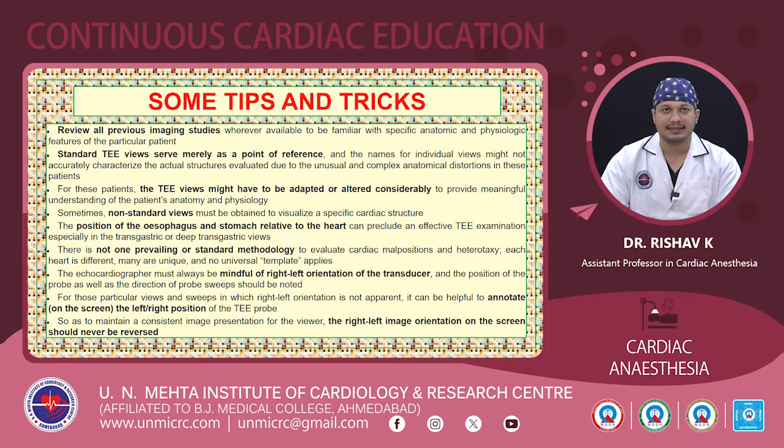Secondly, the standard TE views serve merely as a point of reference. As we know, the anatomy can be hugely distorted in all these patients, and therefore the names of the individual views might not accurately characterize the actual structures evaluated. Also, these TE views have to be adapted or altered considerably in order to provide meaningful understanding of the patient's anatomy and physiology. And non-standard views have to be obtained in most of the cases.